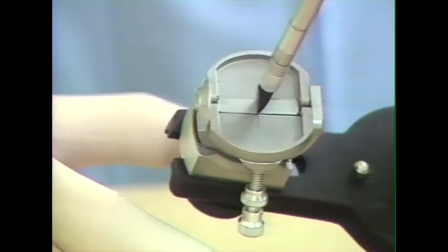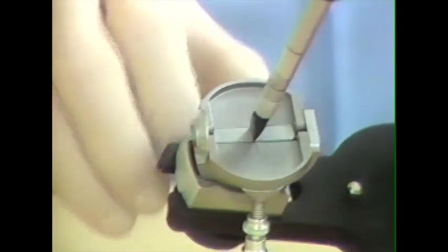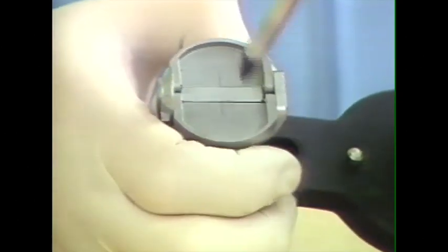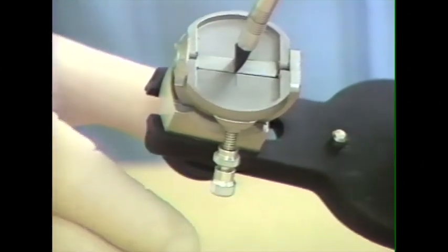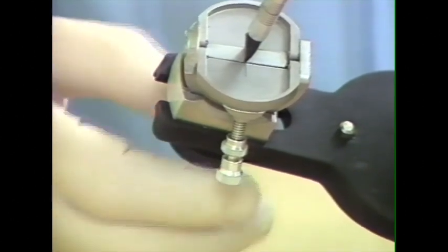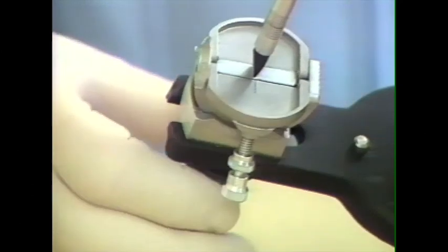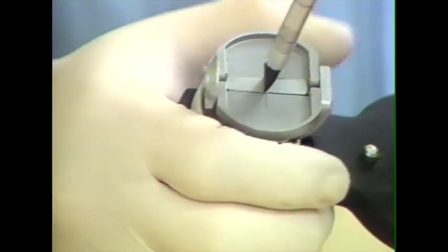The incisal guide table is adjustable both anteroposteriorly and for the lateral rise. It also is removable, and a custom incisal guide table can be substituted. It has a marking on the center of the incisal guide table that allows the incisal guide table to be set, to be varied without changing the vertical dimension. There are separate screws to lock the incisal guide table in place and a separate one to lock the inclination.